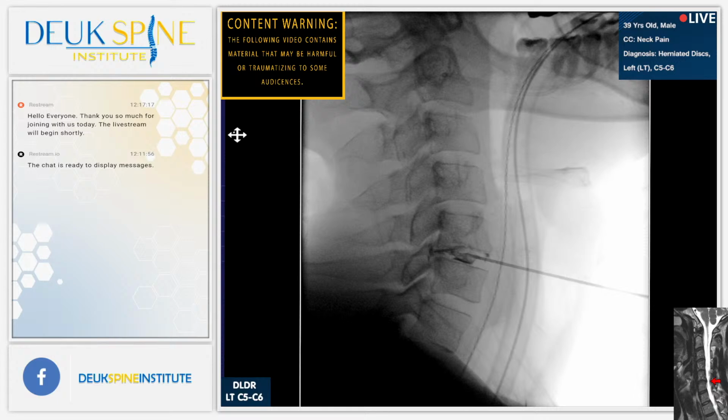All right, I want one with the arrow on the tear. Go back to that, Jordan. Again, Henry, just capture that right there. And then drop your arrow a little bit, Jordan. There we go. Perfect. That right there. Get that right there, Henry. Let me know when you got it. And then get the herniation. Just go below it. Right there. Perfect. That's the herniation.